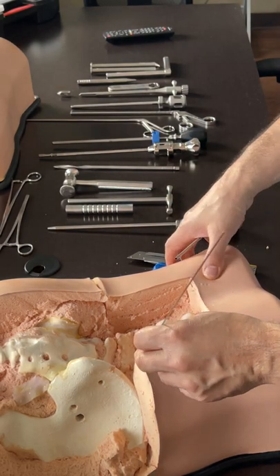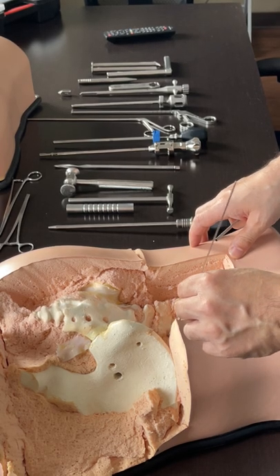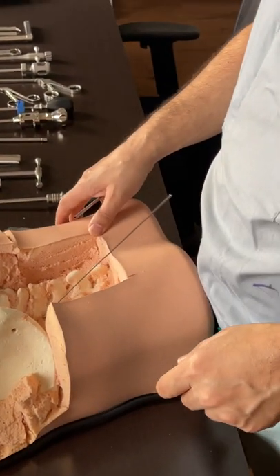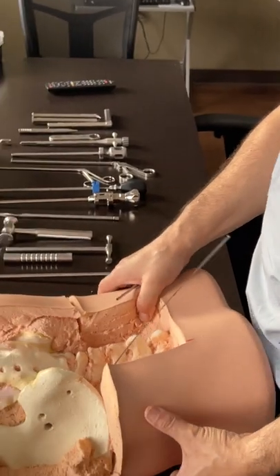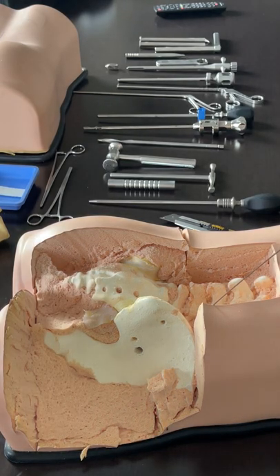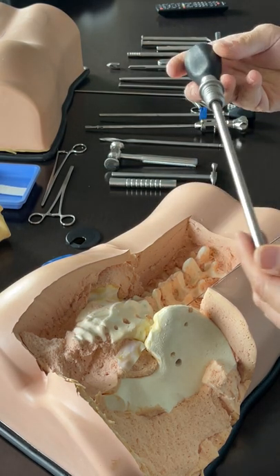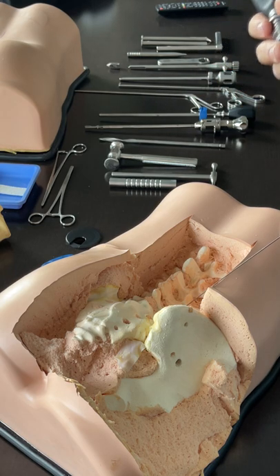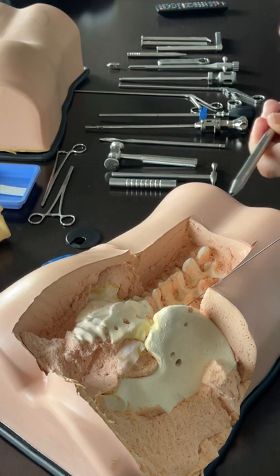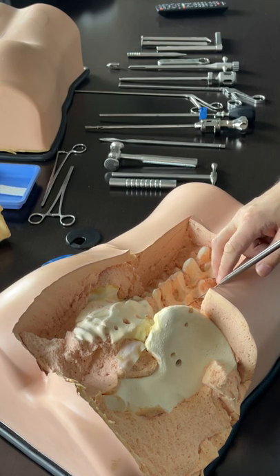Once I have that path, once the K-wire is in place, the first step is the dilation. These are the parts of each of the instruments. The dilator goes through the skin, but then the fascia will give you resistance - this is one of the first perks. If you try to force it, you may bend the K-wire.